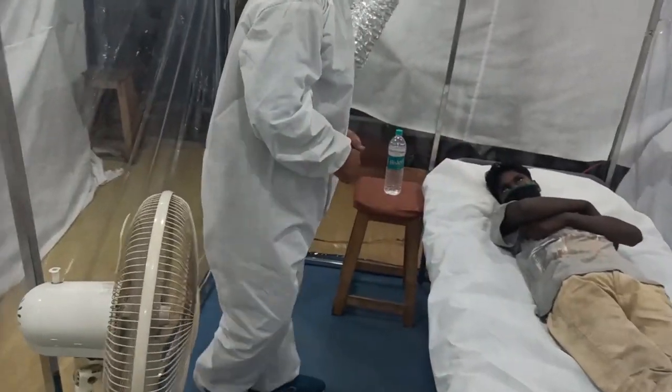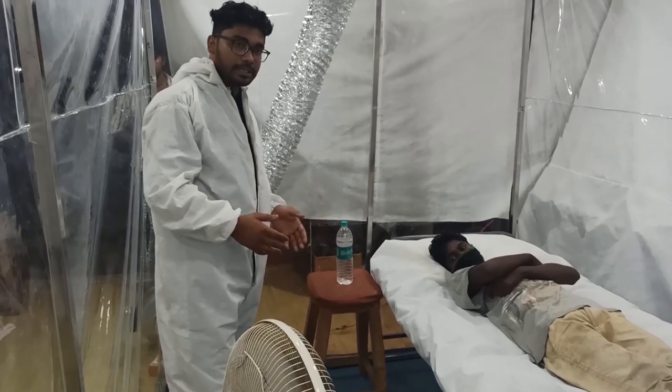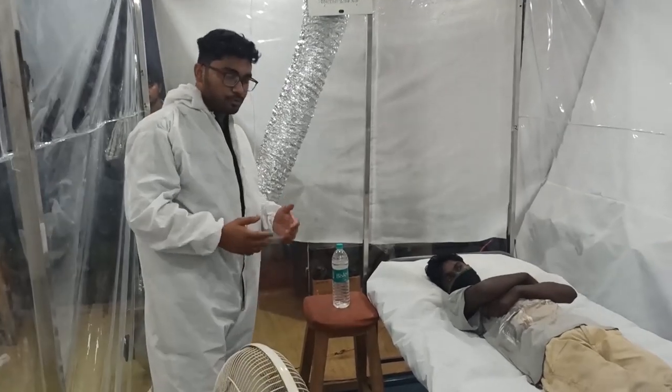There is considerable space within the room for a bed or a set of waiting seats. Life support systems or monitoring equipment such as a ventilator or ECG can be kept here. Tables and a fan can also be kept here for the comfort of the patient.